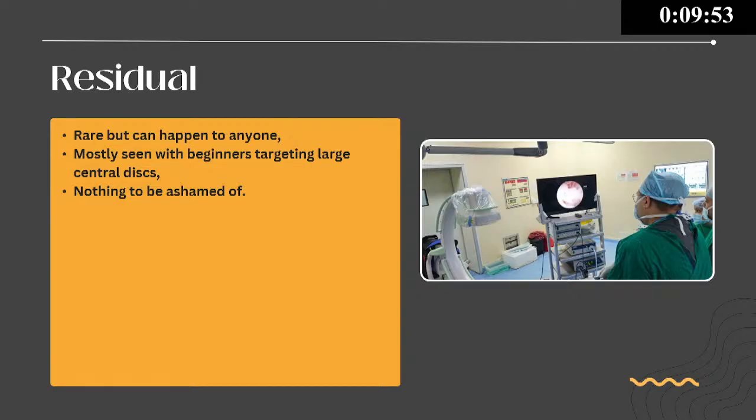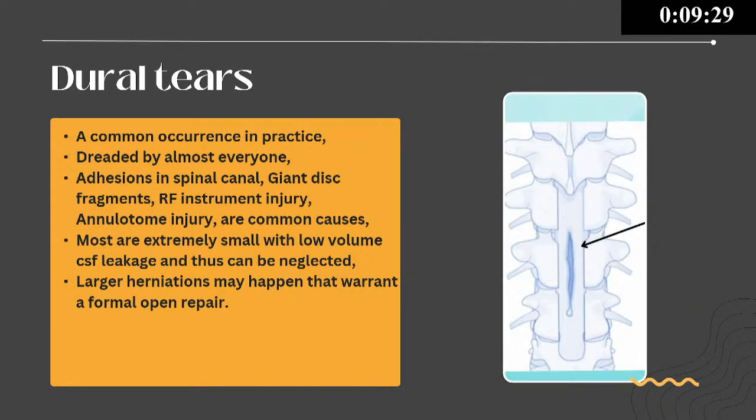But residual is somewhat particular to the technique, because initially what happens is you are taking a lot of time doing the bone work and your bony decompression is not complete. You're not able to retract the lumbar dura completely. You're not able to expose the shoulder properly. So this happens, and residuals in the initial part will be there, especially for a central disc and a foraminal disc, because these are two discs which are not easy to do when you are taking up UB initially.